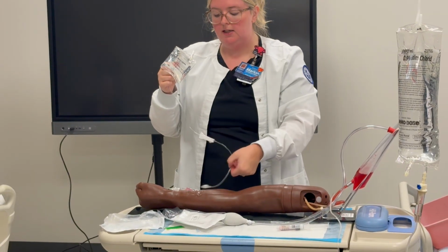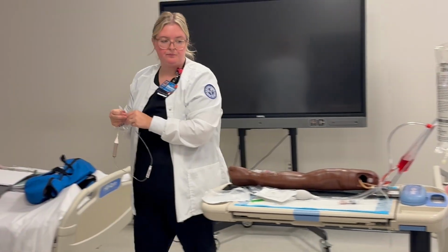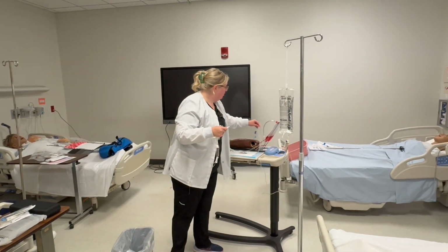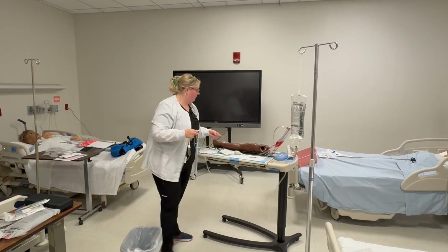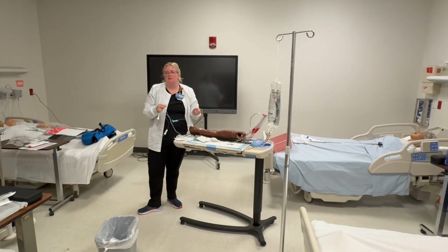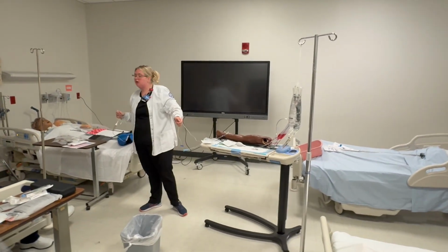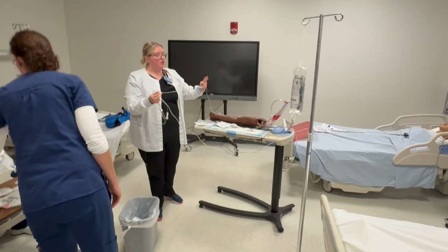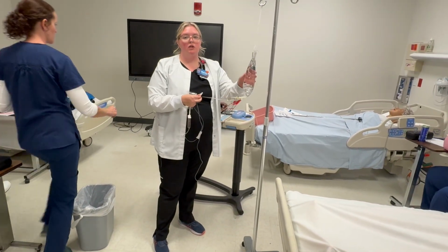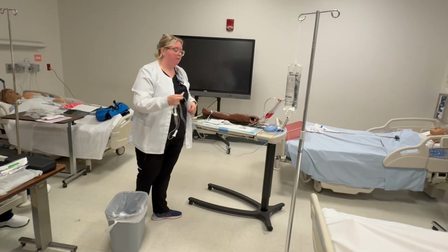We're gonna be doing a technique called back priming. So you can leave your cap on for this, but you wanna keep track of it. This is the wrong tubing. I'm gonna have to do it down here. That's okay. You guys have the correct tubing. I think this tubing is wrong. Oh, it doesn't have the extra port. Your guys' tubing is correct. So this tubing, it's an older one, but you want to use the port that's closest to the primary bag, okay? So I'm gonna use this one here just so I don't have to reprime another tubing.